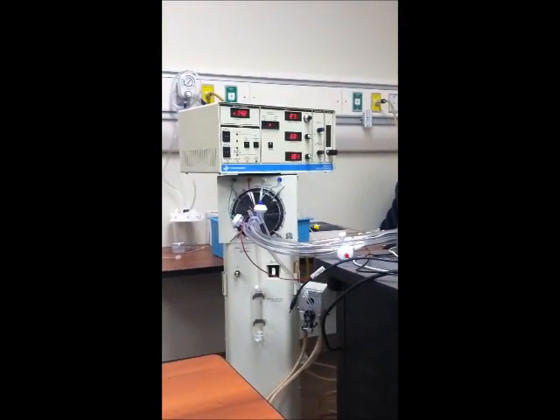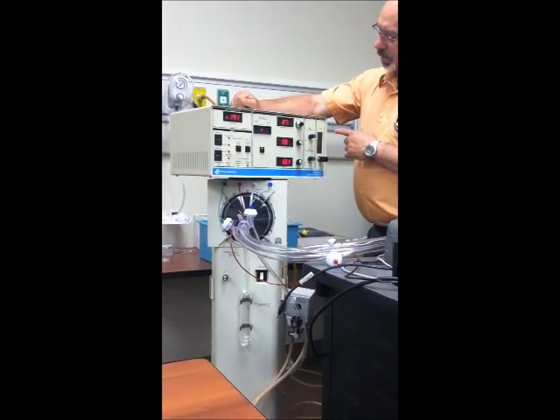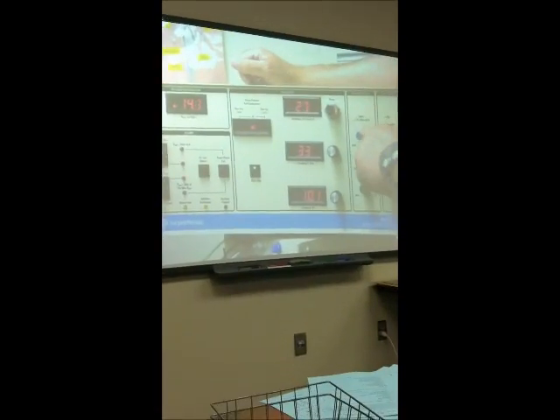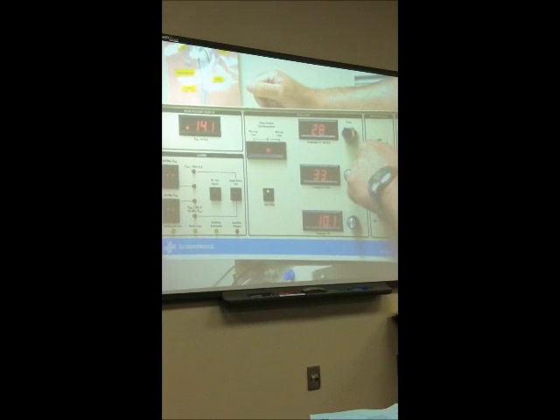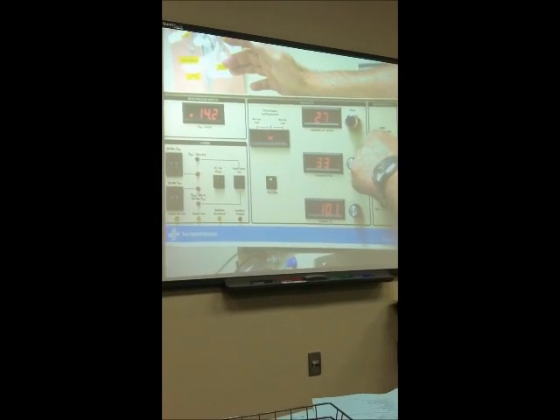Okay, so then what else do I need to do? Just like any other ventilator, set my alarms. Now this is one where I can just go through here and say, is everything set? I don't even have to guess. I do need to change this one. So again, I'm going to turn it back until it starts to drop that.